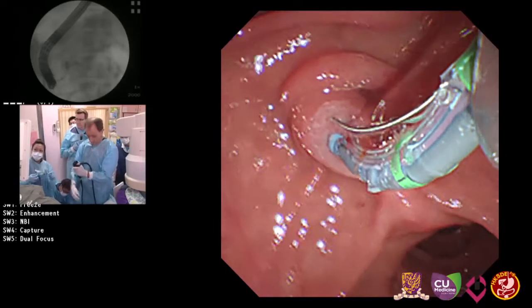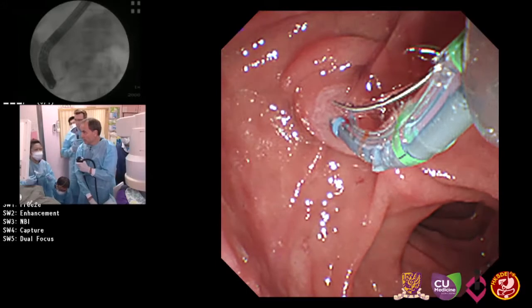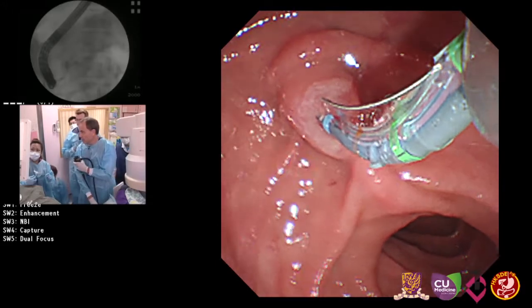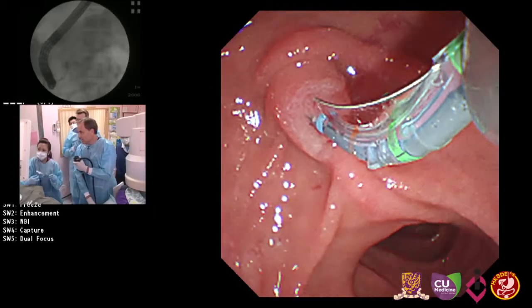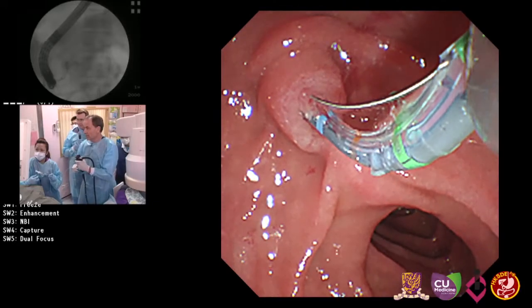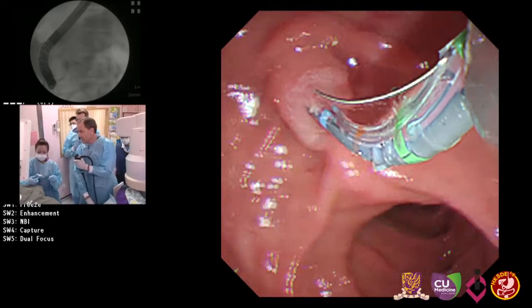What was the purpose of switching off the endocut? You want pure cut, a pure cut to minimize thermal injury on the pancreatic orifice. Maybe it can reduce the risk of pancreatitis and also restricturing or stricture formation. Yeah, but there is no scientific proof for it. Bend it a little bit more.